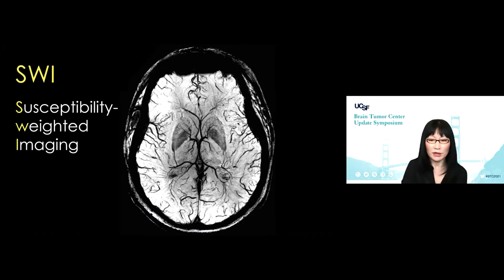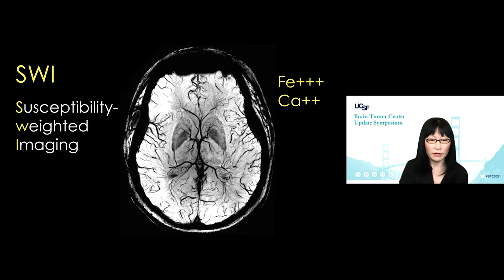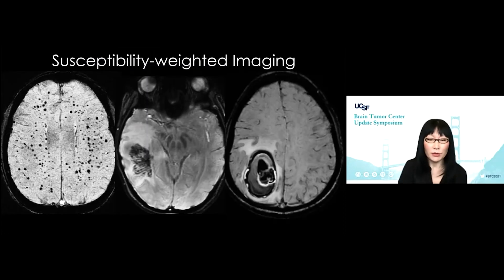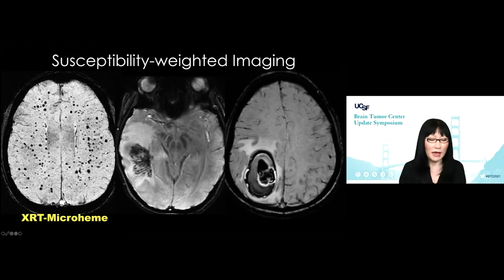Let's start with susceptibility weighted imaging. We now have unprecedented detail of the venous anatomy that we can see with this technique, which only takes about five minutes of imaging time. For brain tumor patients, we acquire this sequence to look for whether we're seeing calcium or iron. There are three patterns we run into: the vast majority of patients, particularly those who've had radiation therapy, will develop multitudes of small micro hemorrhages — the telltale sign that our radiation oncologists have radiated that brain.